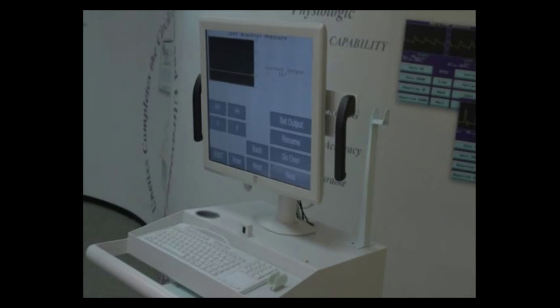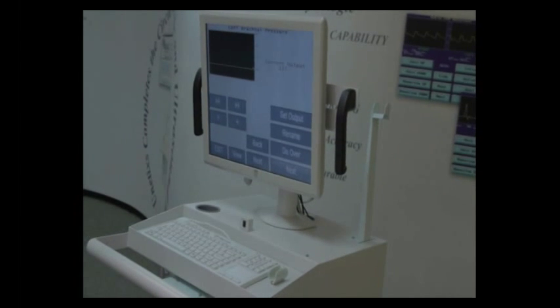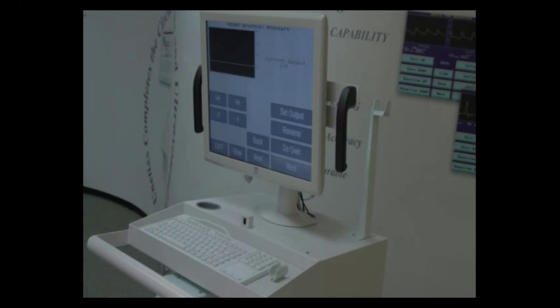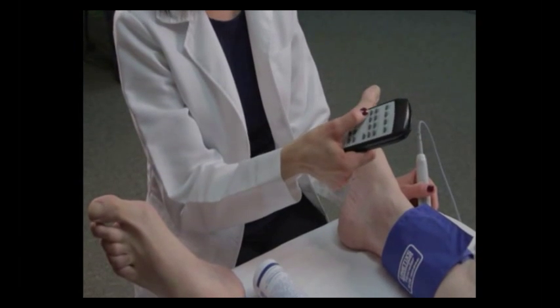Pressure is 117. After I take the left brachial pressure, I like to press the back button and compare that pressure to the right brachial. We have 119 at the right brachial, and we're going to press next, and 117 at the left brachial. We're now going to press next.